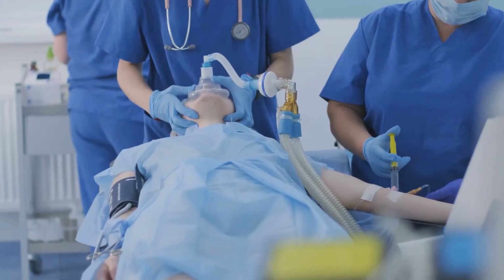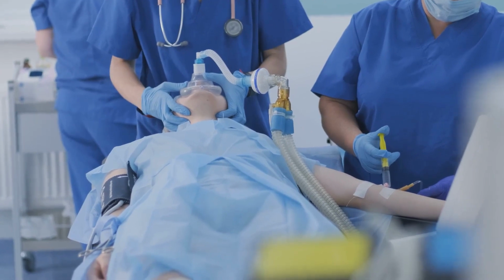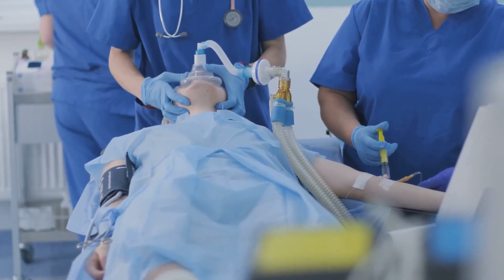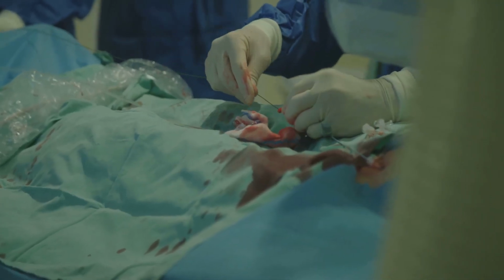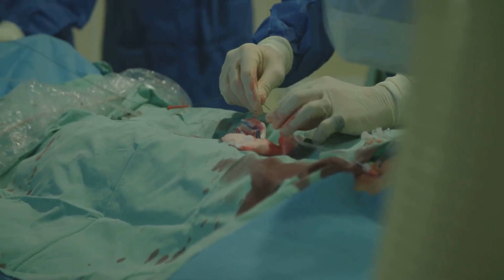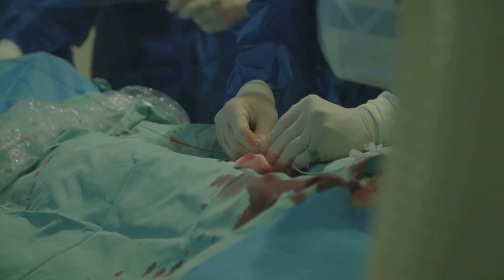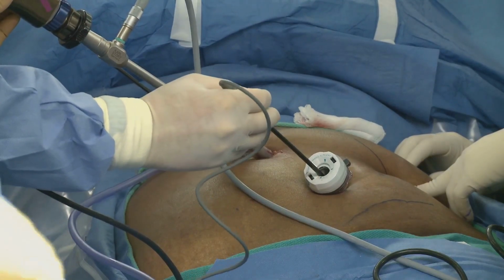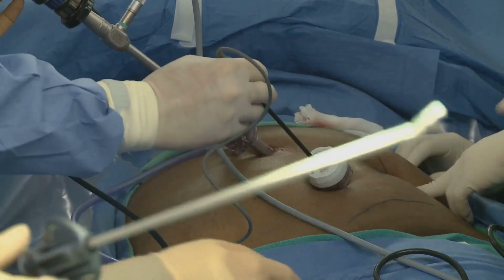So how does this process work? Well, the first step is to properly position and secure the LMA. This is crucial because the LMA is our primary route for ventilation, and it also serves as a conduit for the Aintree catheter. Once the LMA is in place, the next step is to insert the Aintree catheter. The beauty of this catheter is that it has a larger internal diameter, which allows an endotracheal tube to be passed over it, serving as a conduit for intubation. It's kind of like having a guide or a path that leads directly to where we need to go.